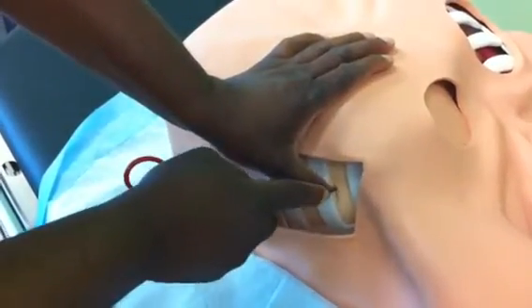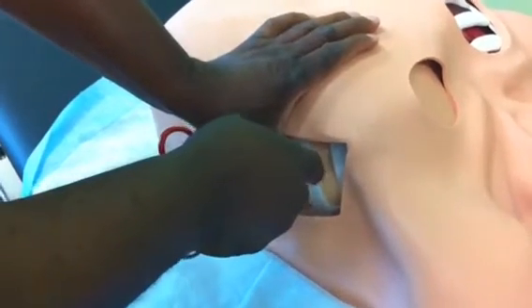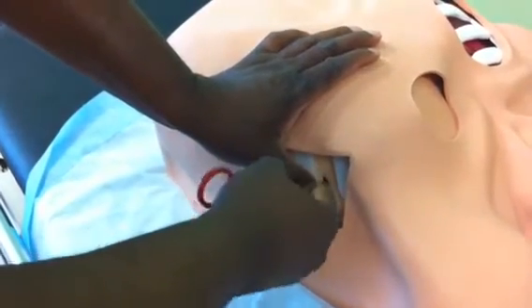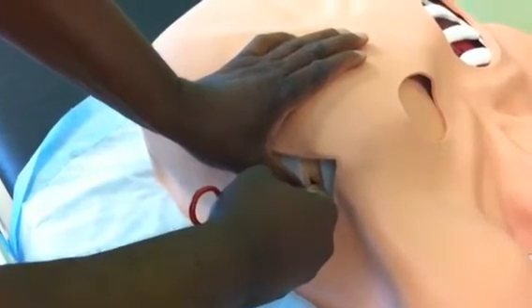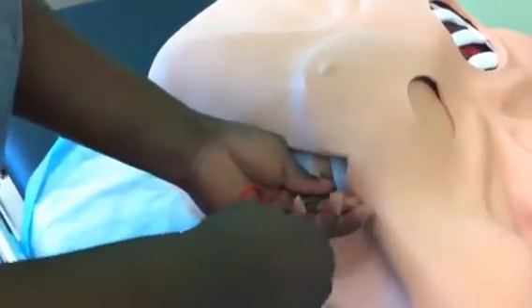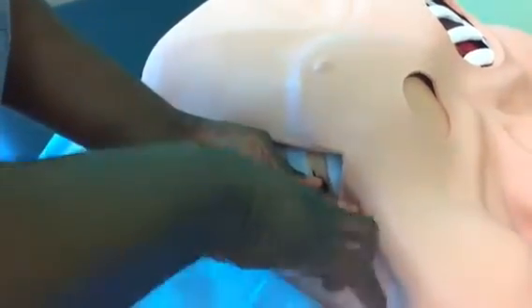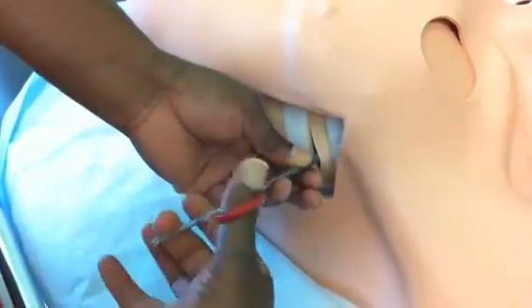Then I put the scalpel down and get my forceps. I go through the skin, over the rib, and keep going until I feel the give, which tells me that I'm in the pleural space. Once I'm in, I hold onto the forceps and try to expand the hole as much as possible so that I won't lose it when going in with the chest tube.